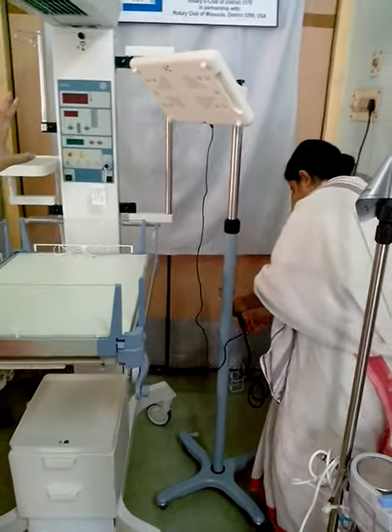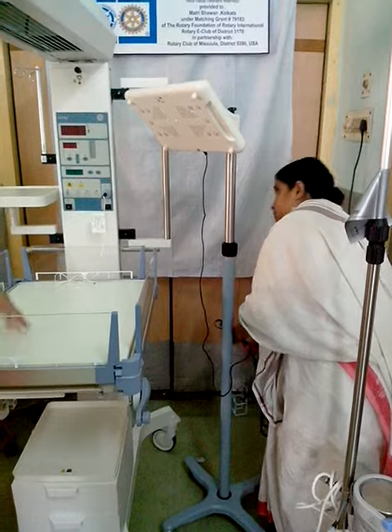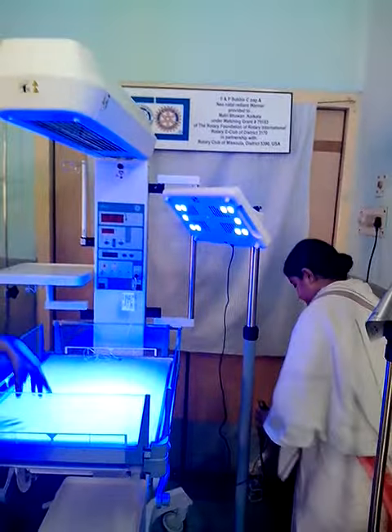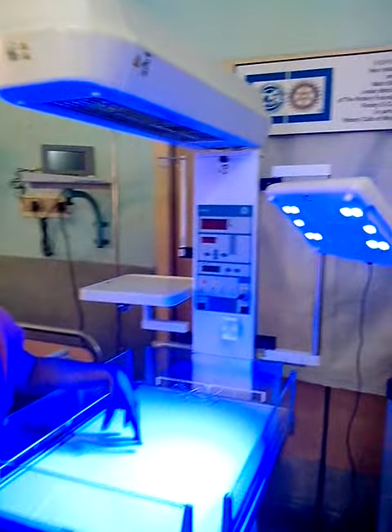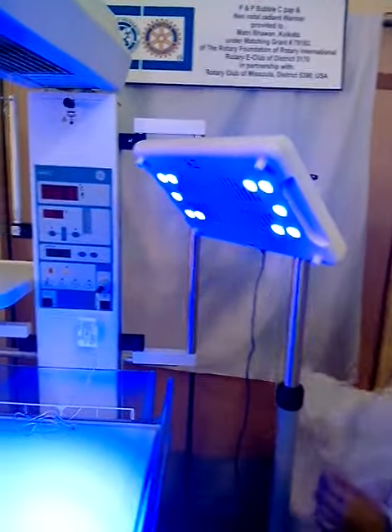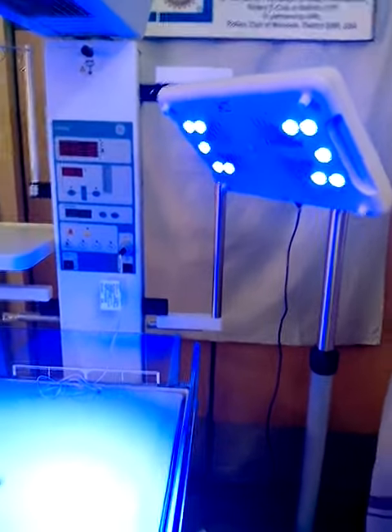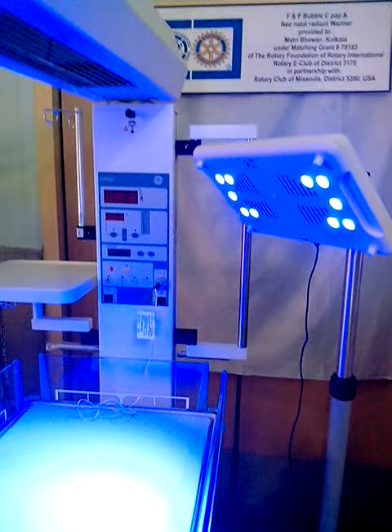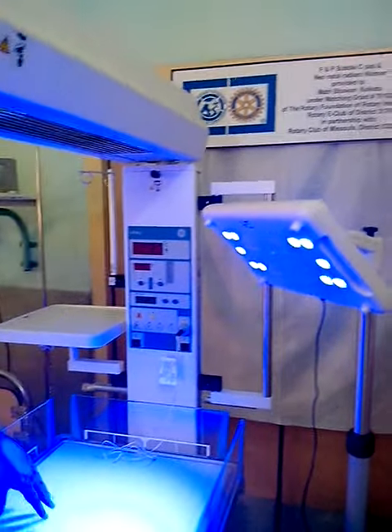What basically happens is it depends on the particular wavelength. If it is very powerful, the baby doesn't have to stay under this light for a long time. The plus point is it is very compact and very powerful, and it helps in a lesser duration stay for the baby on phototherapy, which has added advantages because you can't put a baby indefinitely on phototherapy.